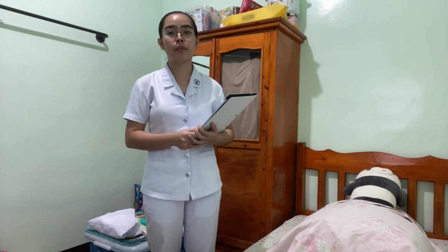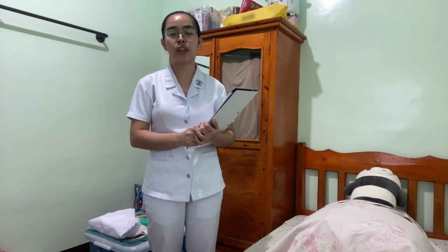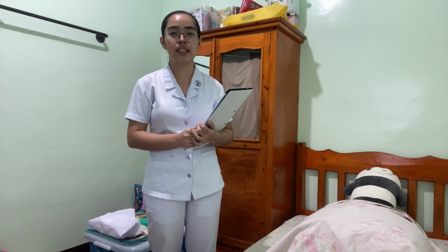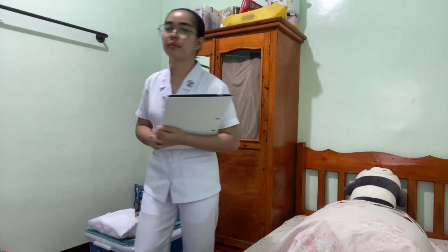So next, I will perform a hand washing before preparing the set. This is to deter the spread of microorganisms that can cause disease and contamination.